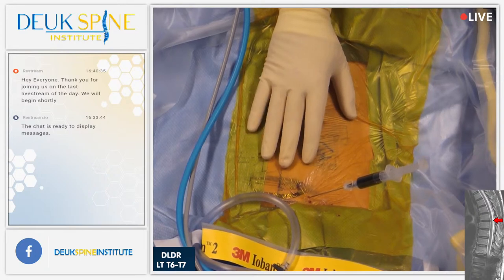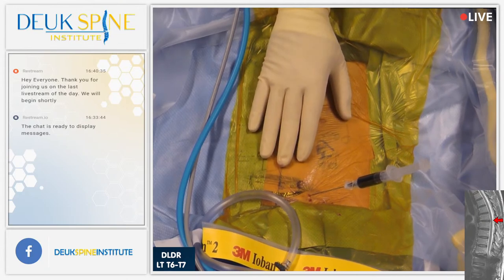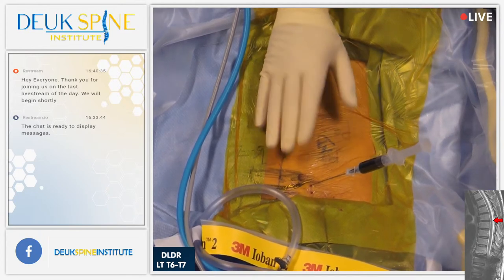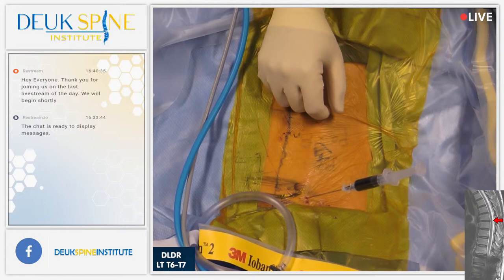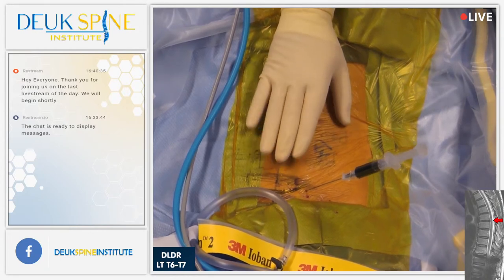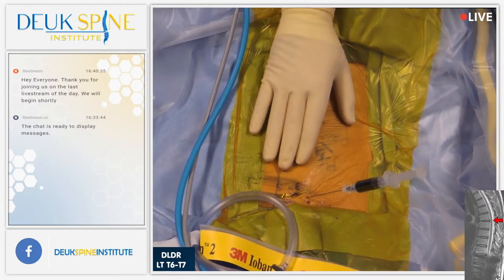She's still somnolent. Can you hear Dr. Deuk? Yes. All right, stop moving and picking your body up. She's picking her body up again. So, again, I don't think she's all there. Can you hear me okay? Stop picking your body up. Keep your head down, please.